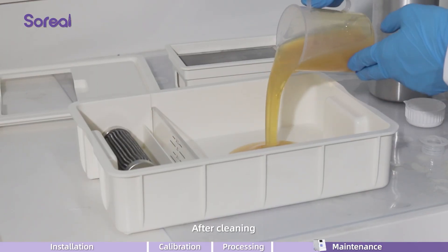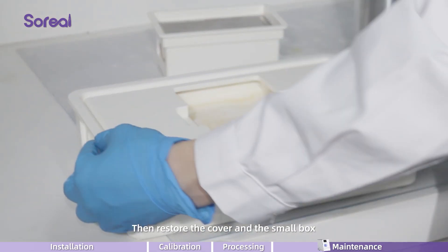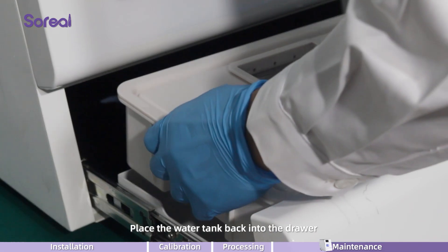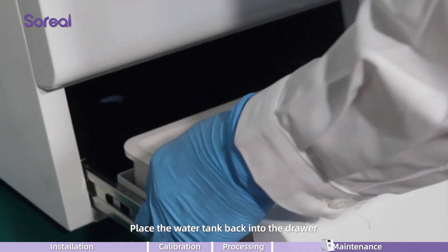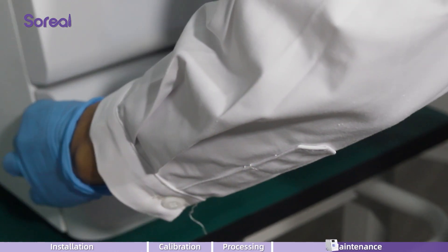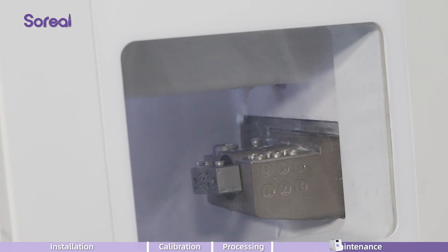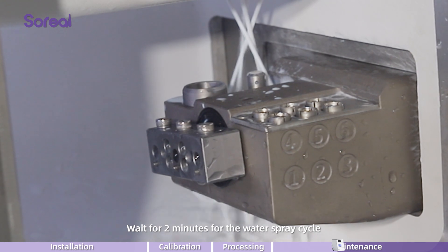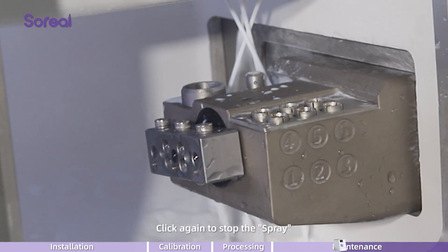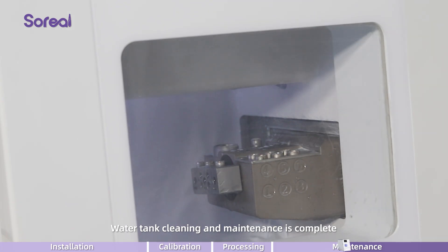After cleaning, add cutting fluid and water in the correct proportion. Then restore the cover and the small box. Place the water tank back into the drawer and push it firmly to close. Click on the maintenance button, then click on water spray. Wait for 2 minutes for the water spray cycle. Click again to stop the water spray. Water tank cleaning and maintenance is complete.